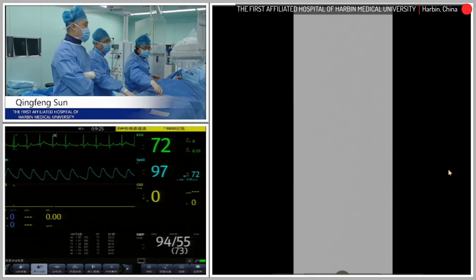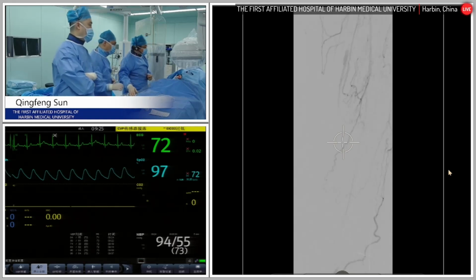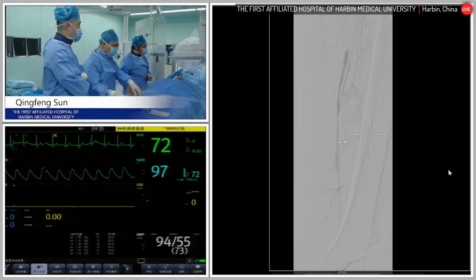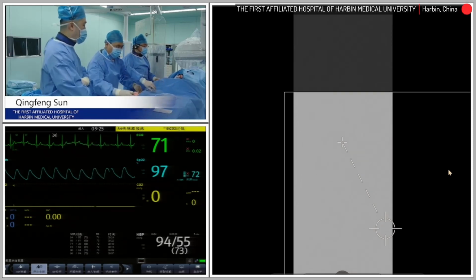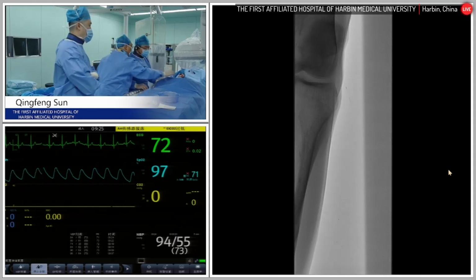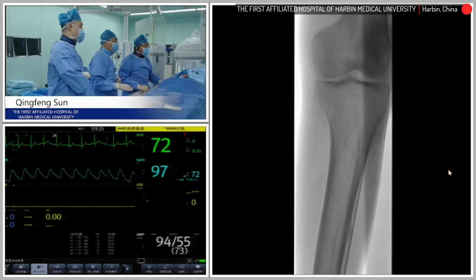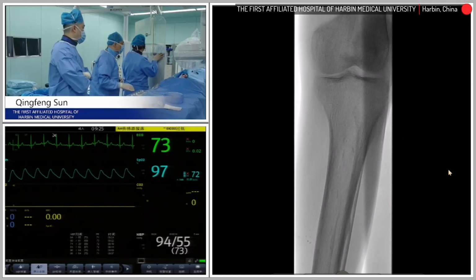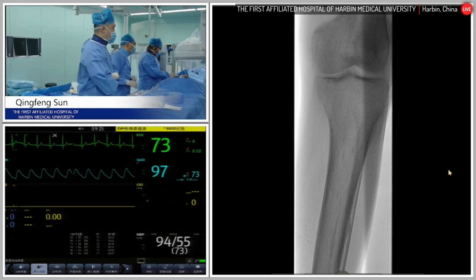For the distal SFA, I think it's all right from the collaterals, right? Yeah. Maybe one or two heart cycles, and you can see the dye going through to the SFA. After we open the proximal iliac artery, it might be getting better. So here we go.